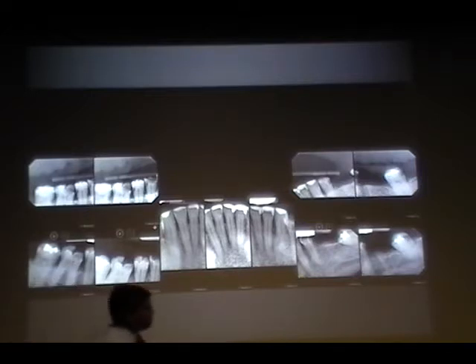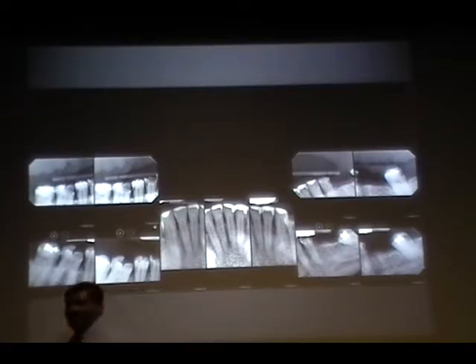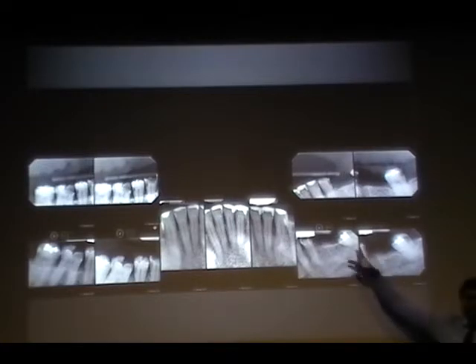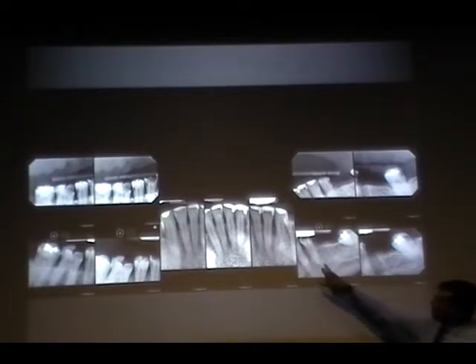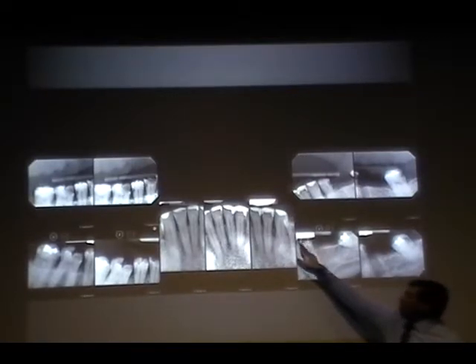How about this one? You have 30 seconds because we have to move on. Looks like the occlusal surface is kind of cut off. Oh, the one on the right? The apex is cut off. Yeah, the apex is missing right here, and of course part of the tooth is missing. How about here? You're able to see a little bit of tooth, but you're still missing the occlusal area.